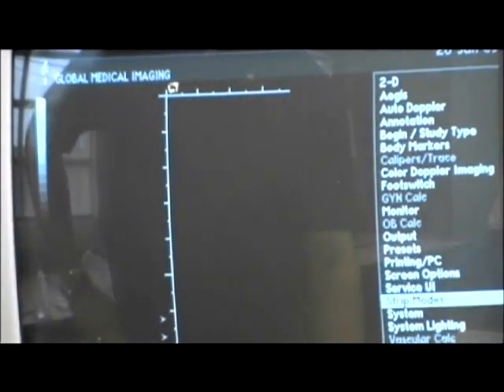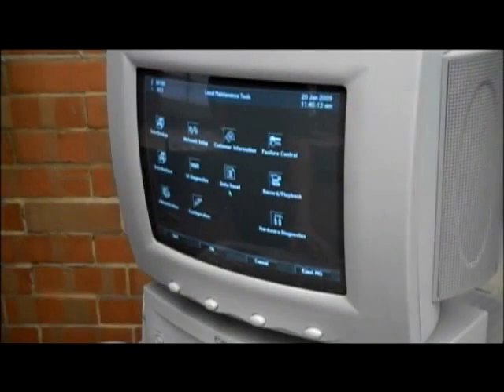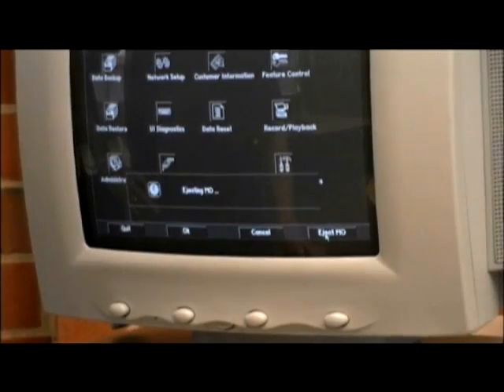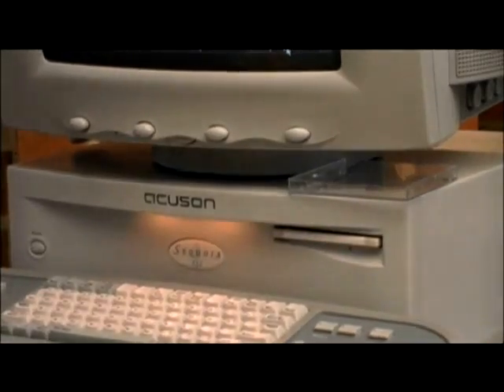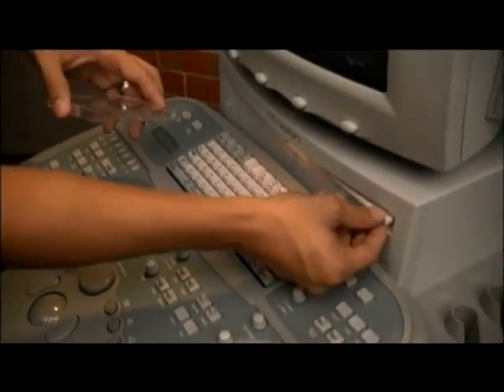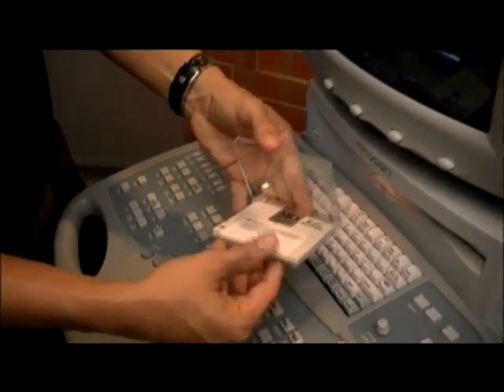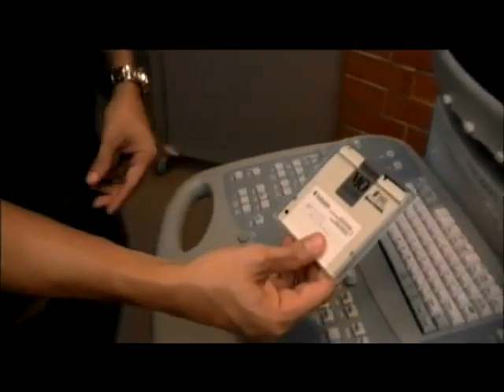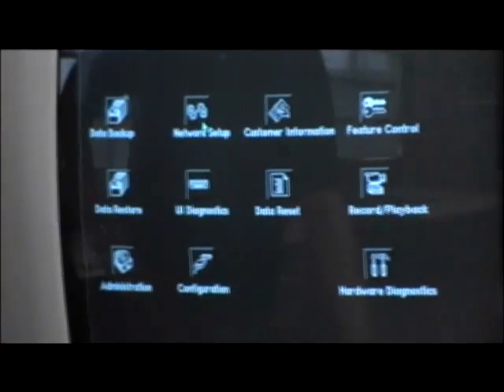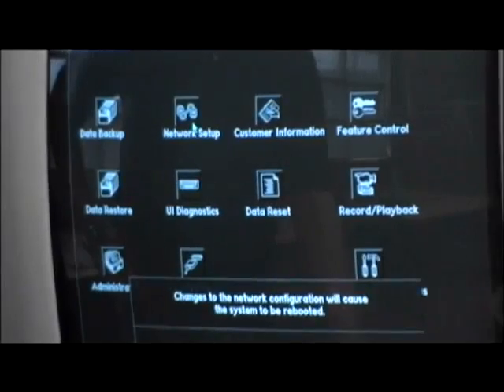Once the reboot is complete, the imaging mode screen will be brought up. From here, go back to SUI. At the SUI screen, click eject MO. Remove the MO disk and place it back in its plastic cover. Store the disk in the front pocket of your machine. From your imaging mode screen, go back to SUI. Click on the network setup icon.